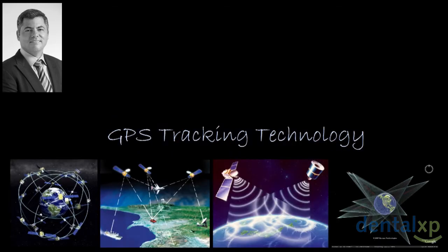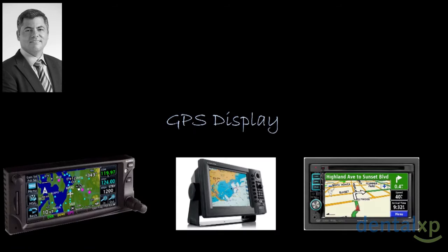This technology is pretty much similar to the way that the GPS tracking technology works. We know that we have satellites in the space tracking our cars, which have GPS units, and these devices are doing the same, are tracking the head of the patient, and are superimposing our scan with the 3D environment, just like the GPS technology is doing with the map when you are navigating a boat or you are navigating a plane or a car.